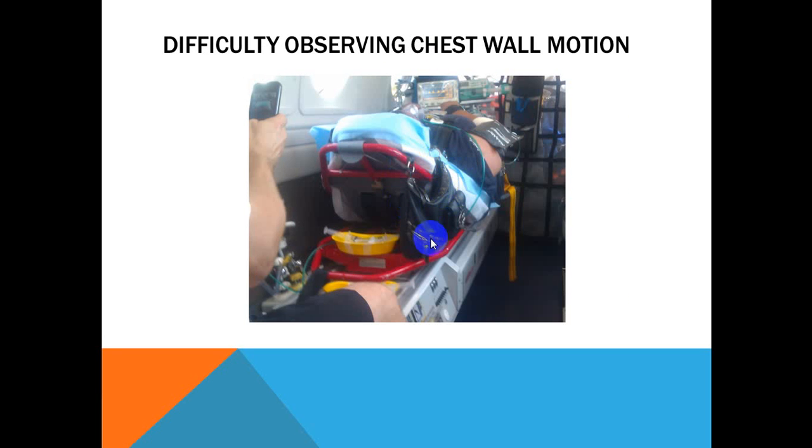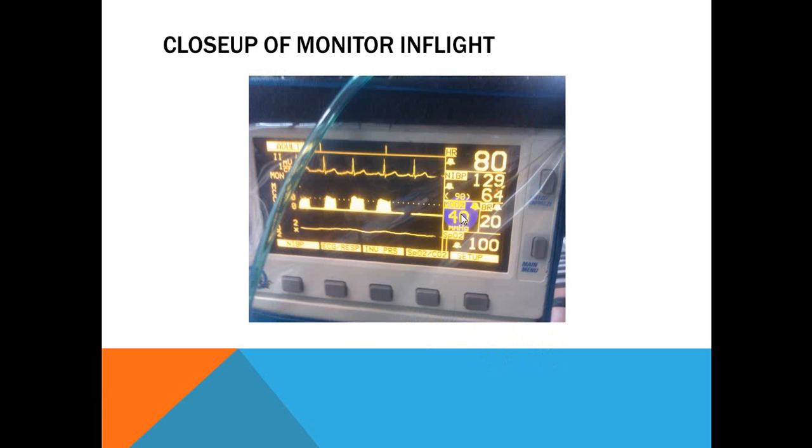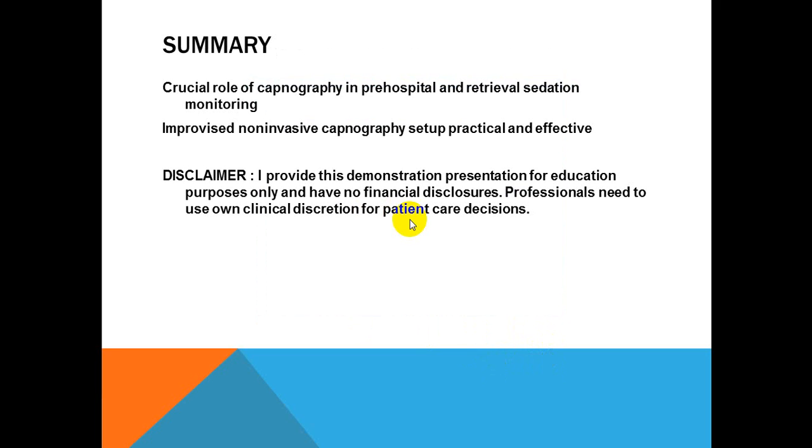You see that the way we're positioned, the nurse and myself here in the front foreground of the picture, we can't actually see the patient's chest wall rise that easily, but we can see the end-tidal CO2 trace quite easily. This is a close-up of the monitoring in flight with a nice end-tidal CO2 trace. So in summary, I believe there's a crucial role for capnography in pre-hospital retrieval sedation monitoring, and that you can have an improvised non-invasive capnography setup using your usual mainstream end-tidal CO2 sensor and system, and it's practical and effective.